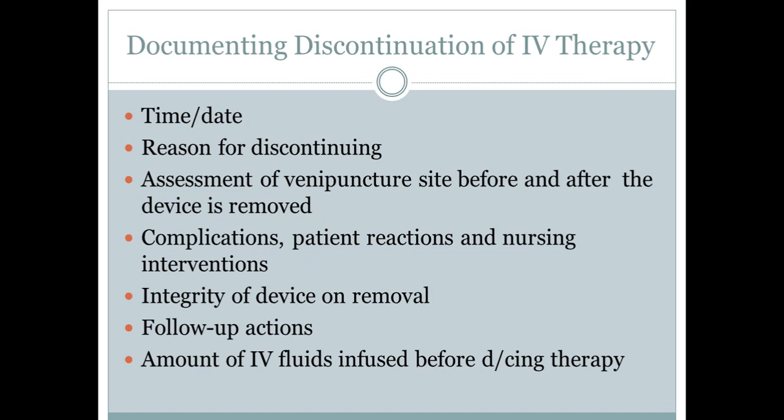Not only are you going to be documenting when you start an IV, but you're also going to be documenting when you discontinue IV therapy, as well as that IV catheter. So again, it's the same thing. You're going to have the date and time, the reason for discontinuing, and that the doctor ordered the IV to be discontinued. You're going to look at the site before and after the device is removed and document any findings you have with that, and any complications or patient reactions with the discontinuing.